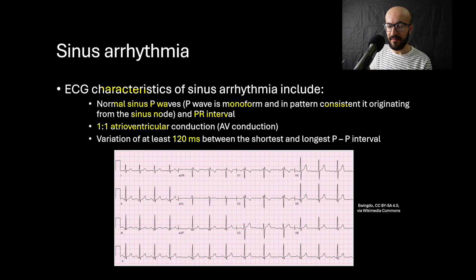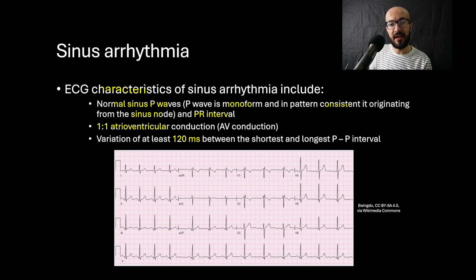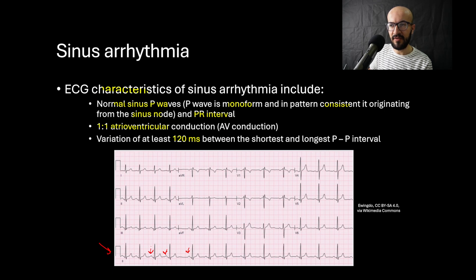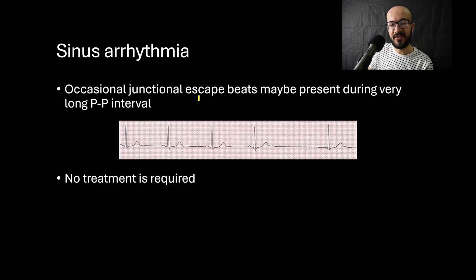On this ECG paper for a 19-year-old female, on the lowest part of the picture we have a strip of the second lead, and you can clearly appreciate some irregularity in the rhythm. There is a huge difference in the interval between consecutive P waves, and this is sinus arrhythmia.